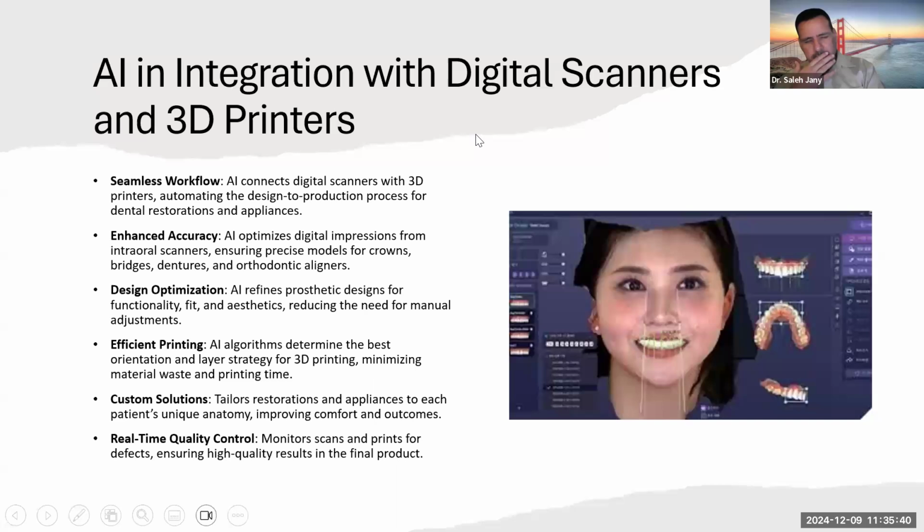we have the digital scanner and digital 3D printer. I think that was before AI, but when we got our 3D printer and our 3D scanner, it already had some AI information that lets you know where the teeth are going to be, and arranges the teeth, the size of the teeth, even the orientation of the teeth, the occlusion. But nowadays they upload more of the facial features. They can upload the TMJ condition too, because the digital calculation is more and more advanced, and everything is on the cloud, and it will be faster.